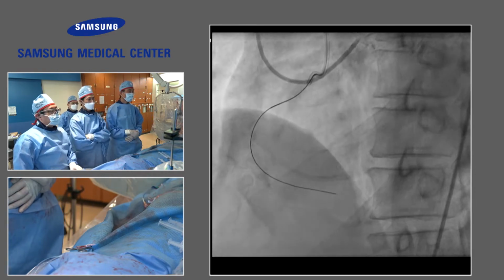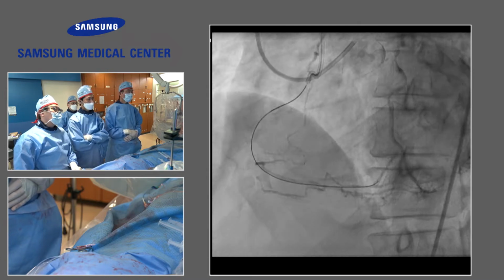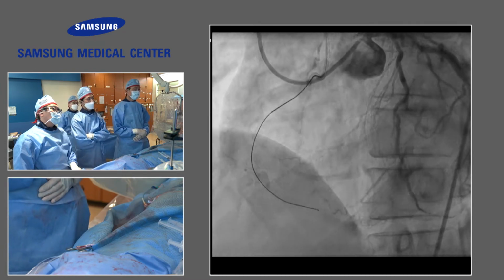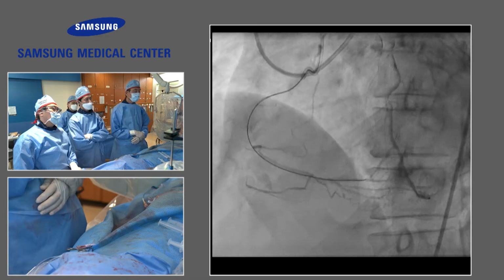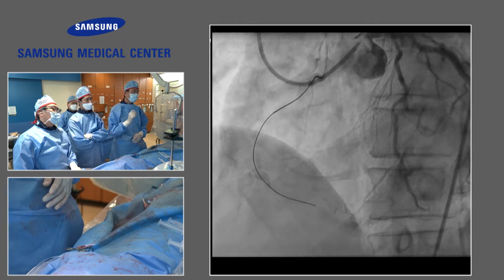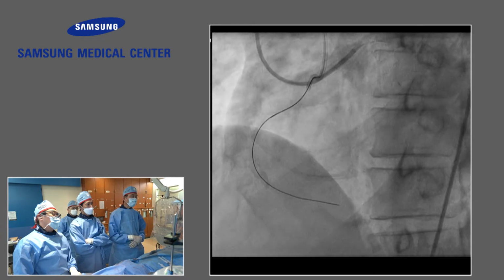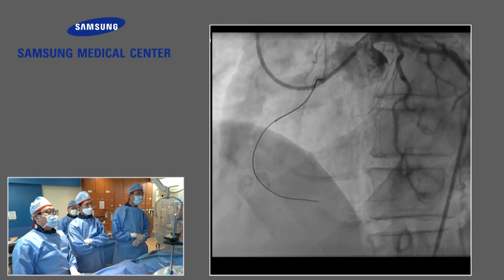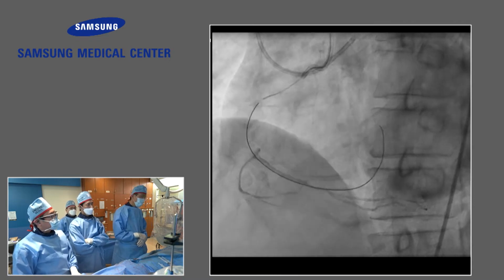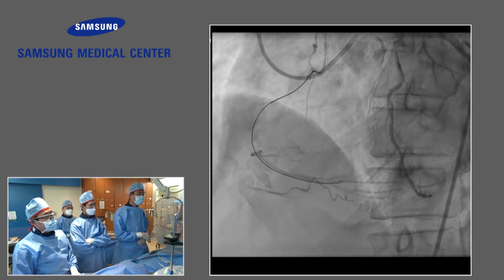Next. Which option did you take instead of a microcatheter? Do you use a balloon? No. I just pushed the wire further with the aid of retrograde angiography. There was some resistance down there, so I did angiography to get the orientation and pushed the wire. Then align the guiding catheter. There is low risk of losing the guiding catheter at this time, and hold the guiding catheter. Dr. Lee, hold the guiding catheter for me. So next.